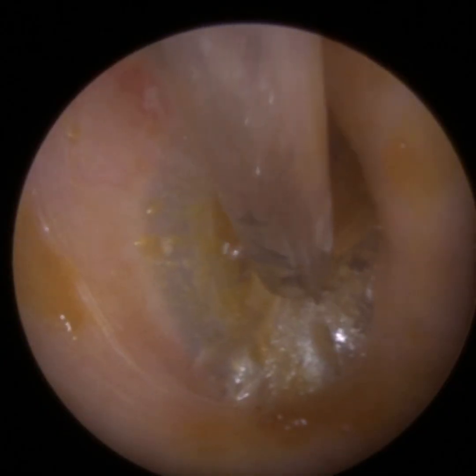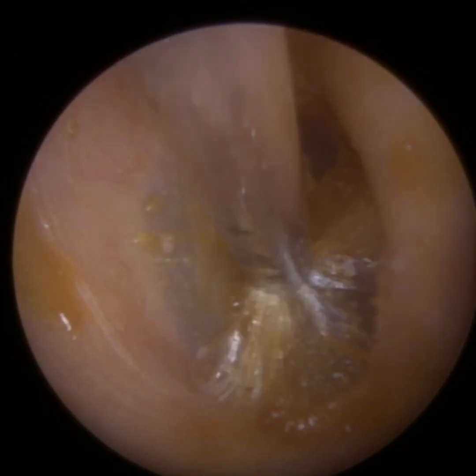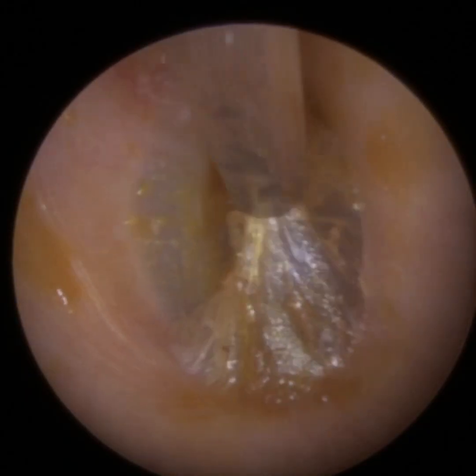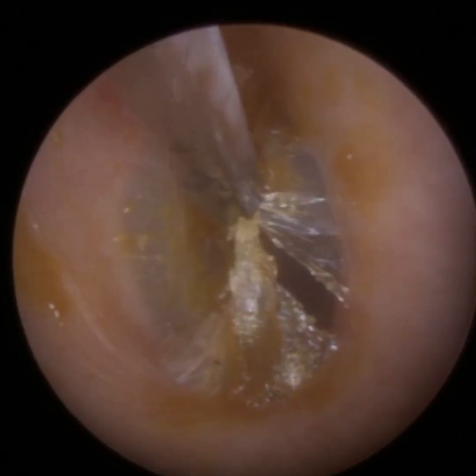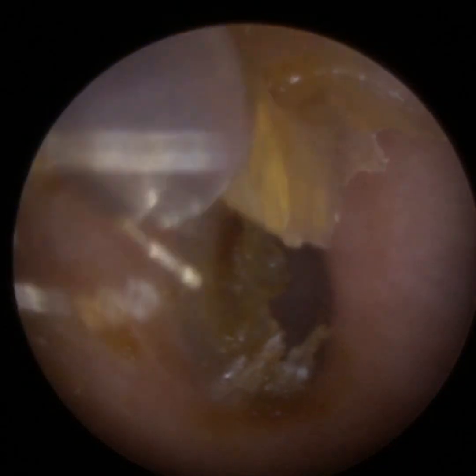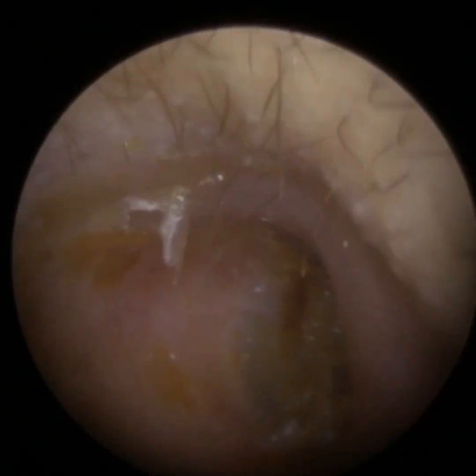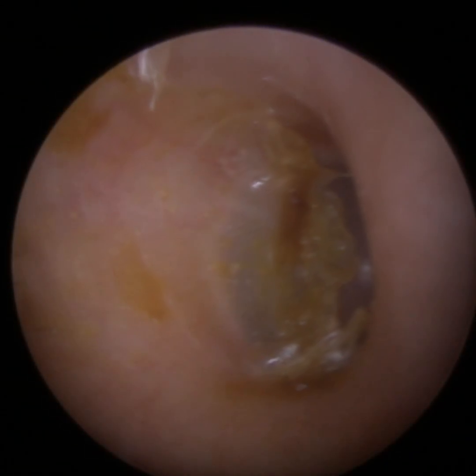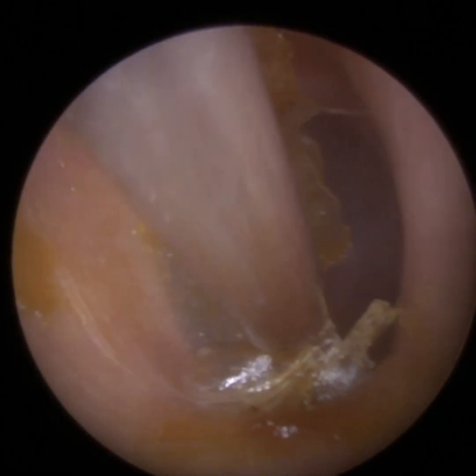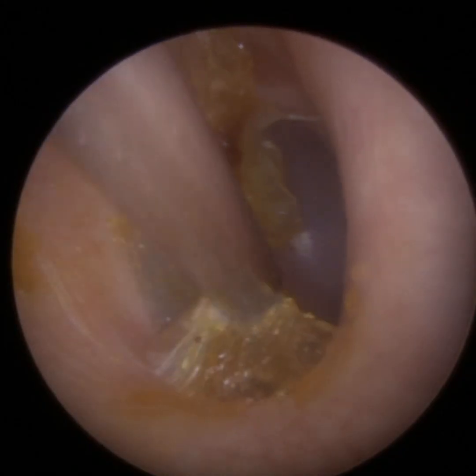Now, unfortunately, what's happened with this patient, and we don't know the exact cause, but we know it started 6 to 9 months ago, is that the skin on the eardrum, as it dies and sheds... So the eardrum is made up of 3 membranes. The outermost membrane that's facing us, we call that the lateral layer. That's the same skin that lines the inner 2/3 of the ear canal. Then you've got a middle layer, a membrane of the eardrum, which is a layer of fibrous and connective tissue. That's what gives the eardrum its strength and rigidity.